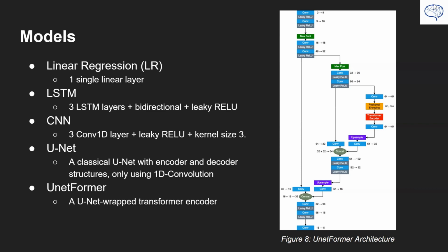So while UNet is good at capturing local and global context information, not all time instances of the ECG signal are of equal importance. Therefore, as we all know, attention is all you need. So as a next step after UNet, we want to try a transformer-based model. The transformer is a sequence-to-sequence model based on the attention mechanism. Similar to UNet, it also has an encoder and decoder. However, the vanilla transformer didn't perform as well as we expected. It didn't capture the local context information as efficiently as UNet.